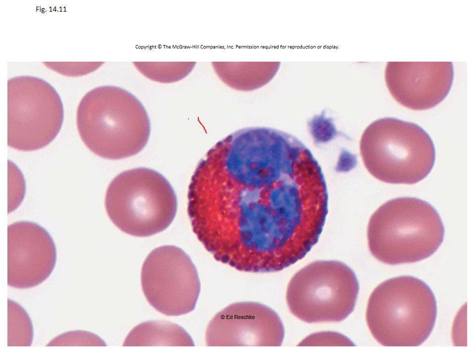So this one's called an eosinophil, and its granules are these really dark red marble looking granules that are in here. And you can see the nucleus, and it actually does have a weird multi-lobe nucleus, not quite as much as the neutrophil. However, that's not the star of the show. The star of the show are these granules, these red granules.